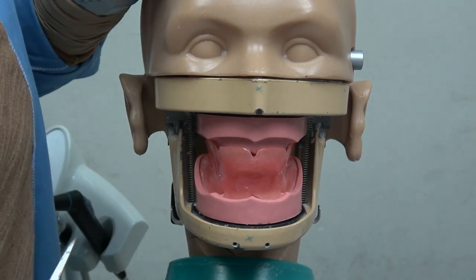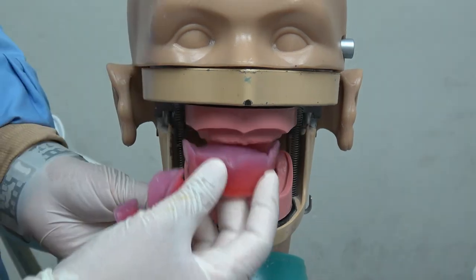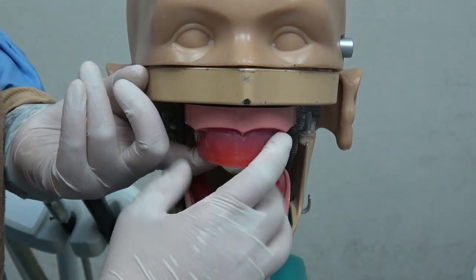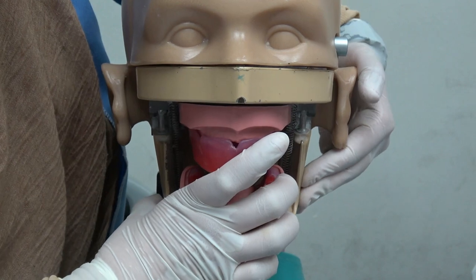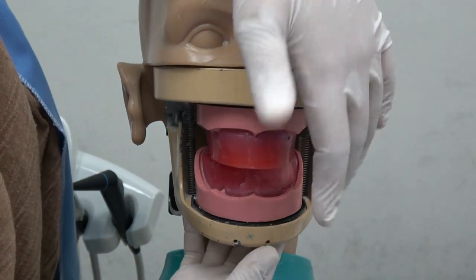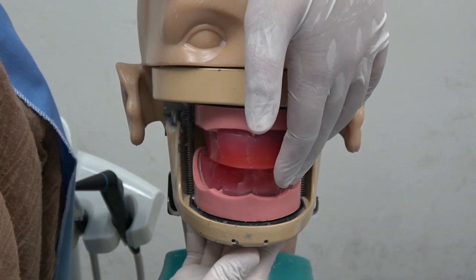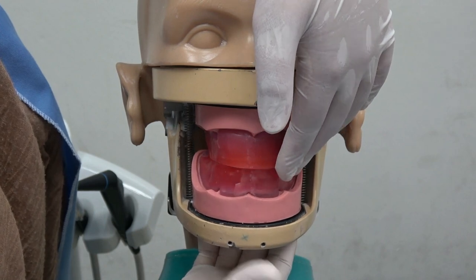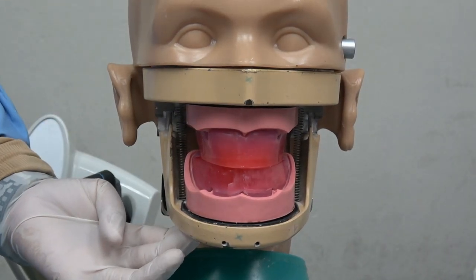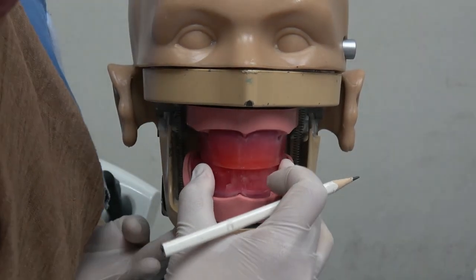RVD is equal to what? This one, RVD is equal to 100. And then put back your occlusion rims, both the maxilla and mandible. Your phantom head will usually bite in Class 2, so we make it Class 1. You bring the lower jaw forward, and make sure the posterior part of your bite rims is flush to each other.